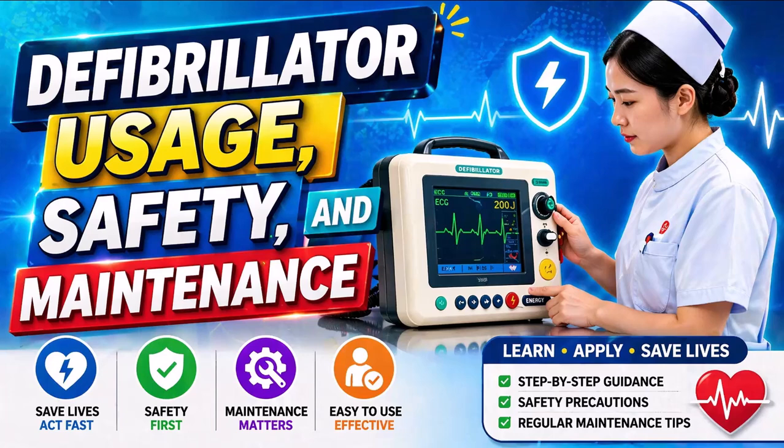Common defibrillator problems include battery degradation, damaged cables, faulty electrodes, and charging circuit failure. In emergency situations, such faults can delay treatment or render the device unusable. This is why preventive maintenance is more effective than corrective maintenance.